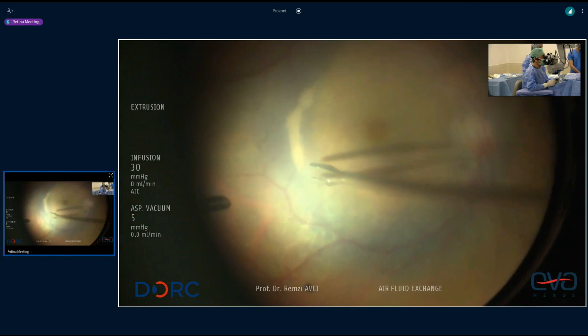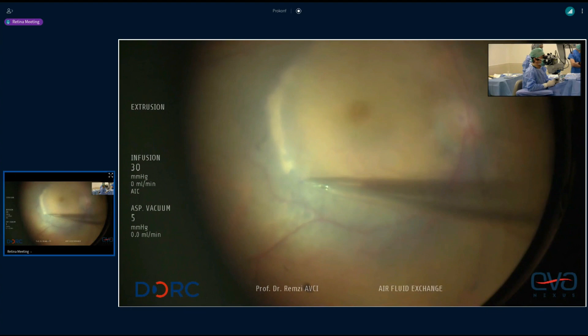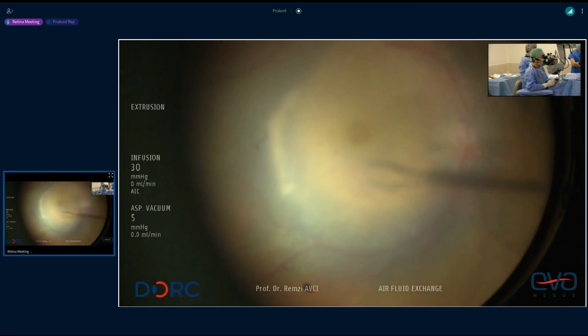I must say, I just use — as Remzi is using — pure brilliant blue G, rather than mixed with trypan blue, and I haven't seen any toxicity. But interestingly, another effect of your technique, Remzi, is that your flap — the bit of the flap that will be over the hole — won't have blue in it either. So you'll avoid any contact of blue with the actual RPE.